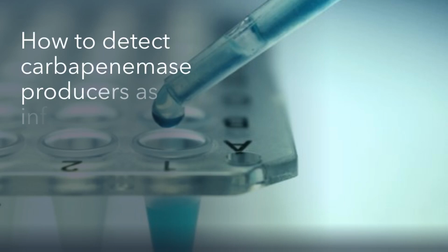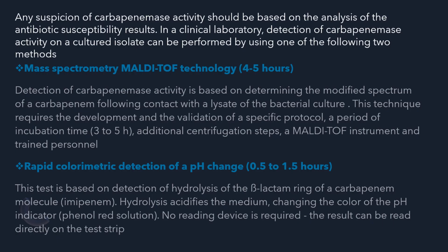Now, how to detect carbapenemase producers as infectious agents? Any suspicion of carbapenemase activity should be based on analysis of antibiotic susceptibility results. In a clinical lab, detection of carbapenemase activity on cultured isolates can be performed by mass spectrometry, that is MALDI-TOF technology, that is matrix assisted laser desorption ionization time of flight mass spectrometry technology, which gives results within 4 to 5 hours. The detection of carbapenemase activity is based on determining the modified spectrum of a carbapenem following contact with a lysate of the bacterial culture.